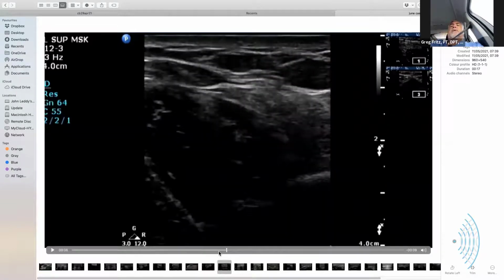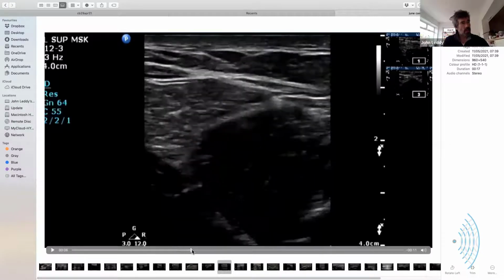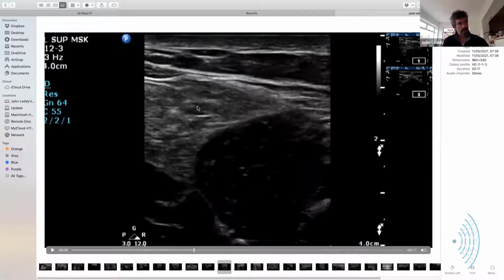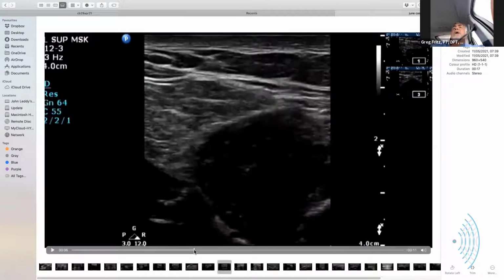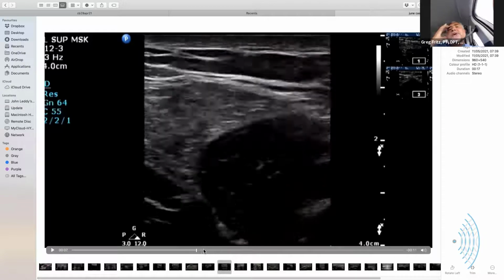I can see it now. Yeah. But you have to almost believe that it's there and then play with the anisotropy to get the contrast between them, because otherwise it just looks like normal muscle. What you just said is so powerful to understand.